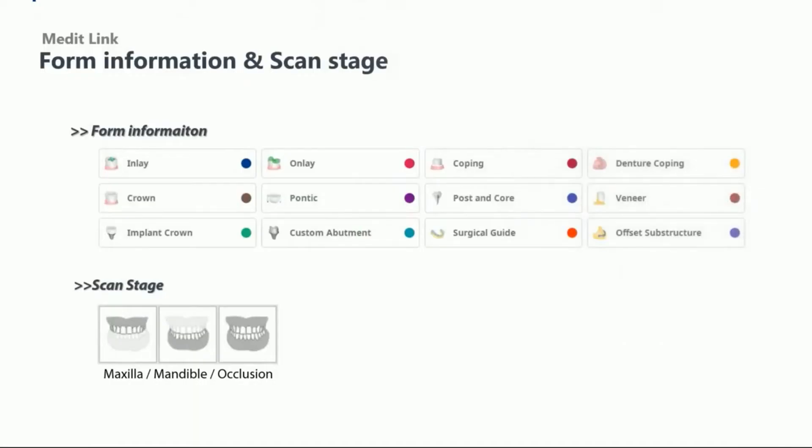General cases such as inlay, onlay, and crowns consist of maxilla, mandible, and occlusion scan stages.